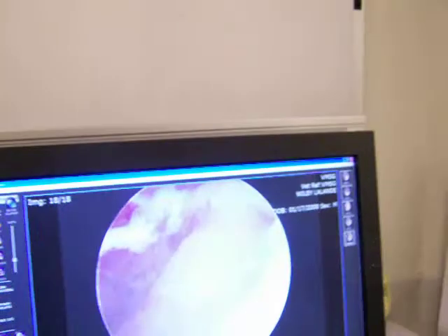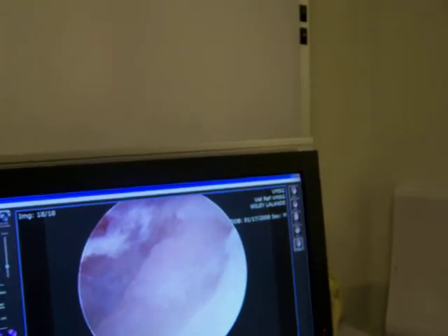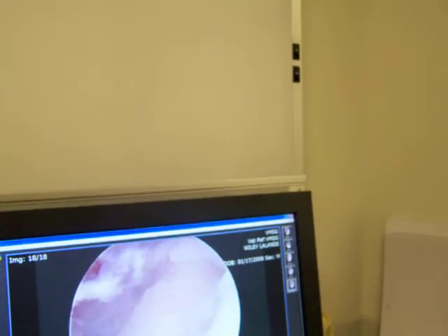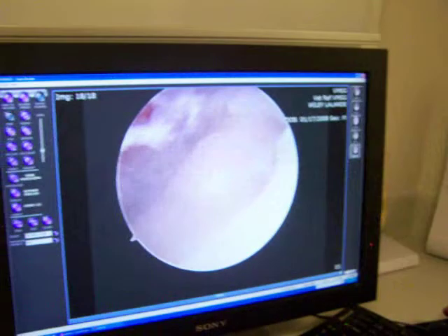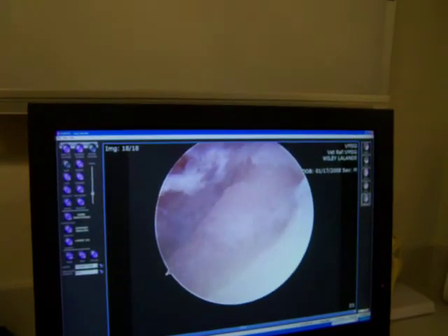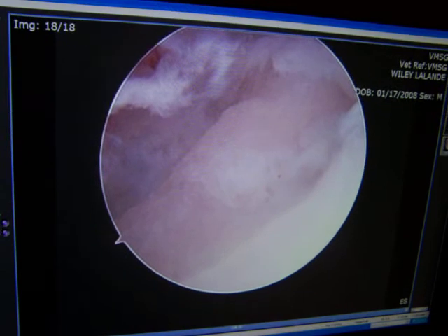On the recovery timeline — you mentioned three weeks minimum but it might be more depending on the size of the lesion. I think four to five weeks would probably be a good idea. I want to see you in three weeks, have a feel of the knee, see how it's going, and then we'll make a final decision on duration. Here's the whole crater — it cleaned up really nicely, the whole flap is out, and I went back and got that little floater piece as well.